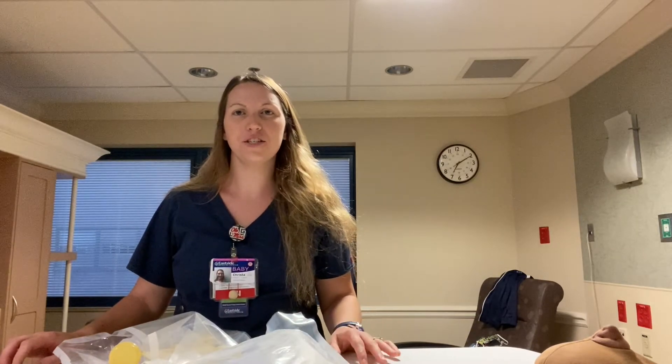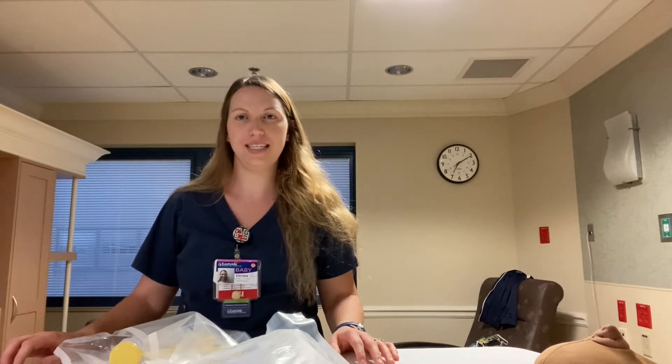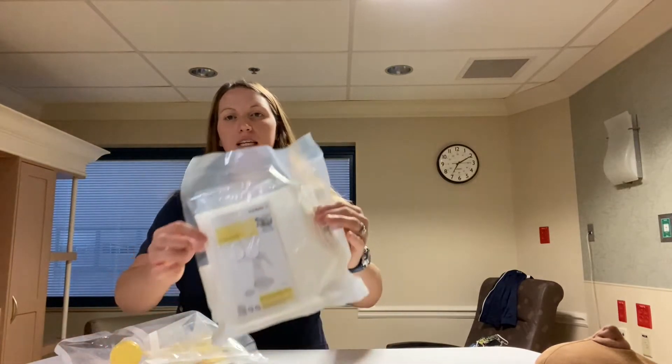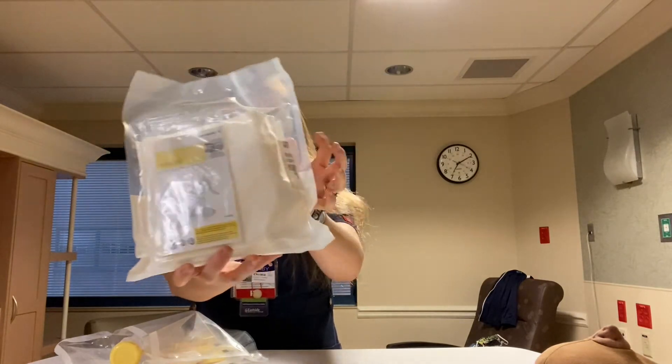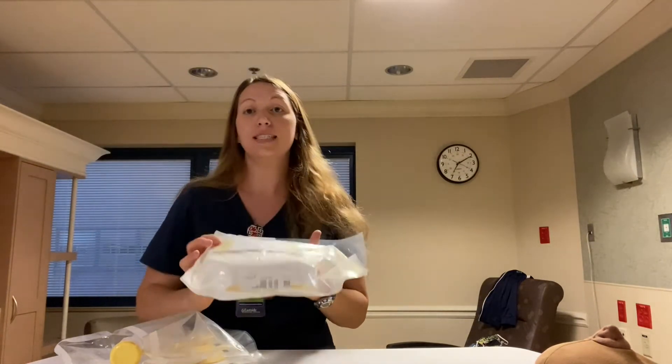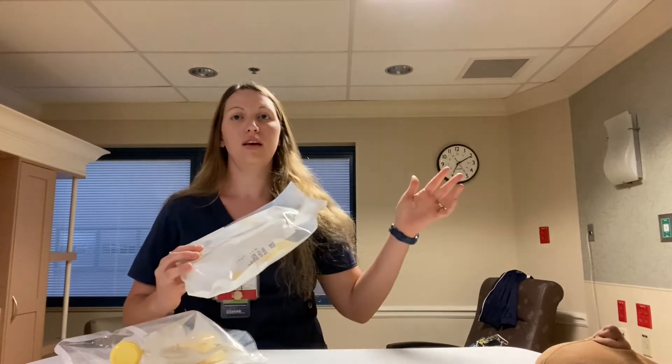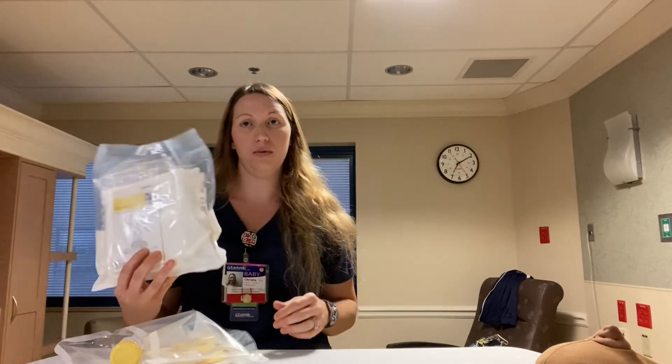Hi, my name is Krista. I'm a registered nurse, lactation consultant, and IBCLC. I wanted to share with you how to use a hand pump today. I take all of this into the patient room so the mom and dad can see me set it up and ask any questions, because they're going to be the ones using this at home by themselves.